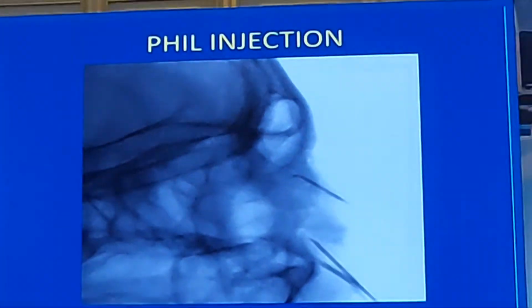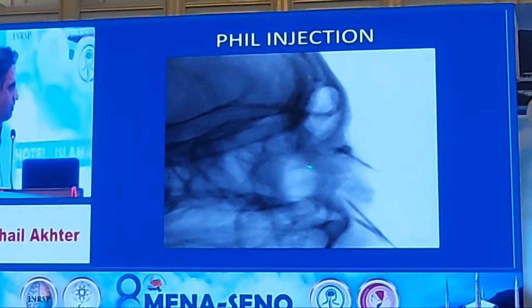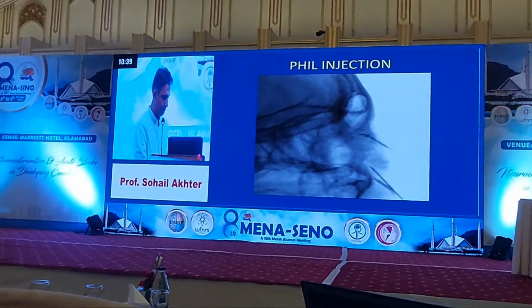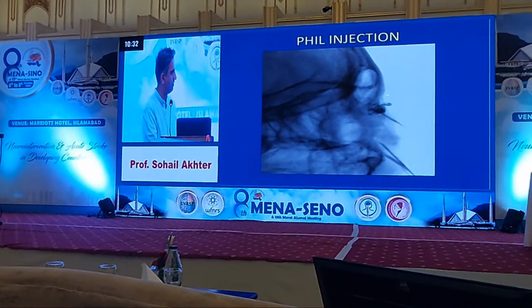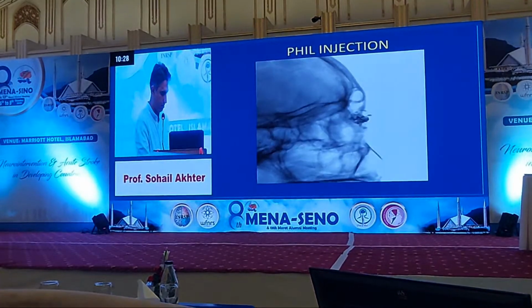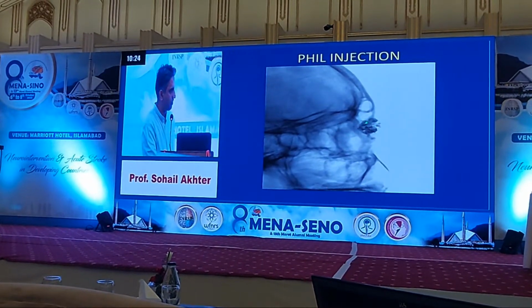It's a bit fast video. You can see the glue injection is being given, how it will fill the small area in this location. Feeders are being filled. Now filling of this part of the nidus.